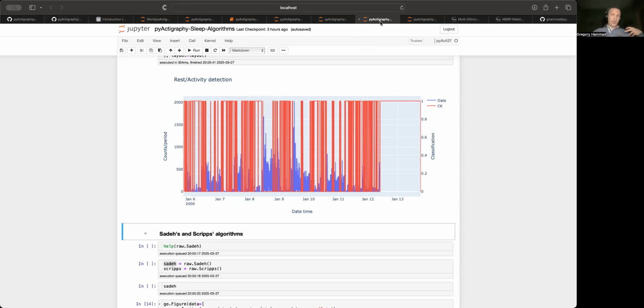Okay, thanks a lot. It was maybe a lot. I know that it's really codey, because we discussed that already with Mike. It's always nice to have a graphical interface, but we can discuss that during the breakout session, whether it's really too much for newcomers or not. I think you need to invest time in learning data manipulation during your PhD. I think it's worth doing it during the PhD, but we can have different opinions on that.